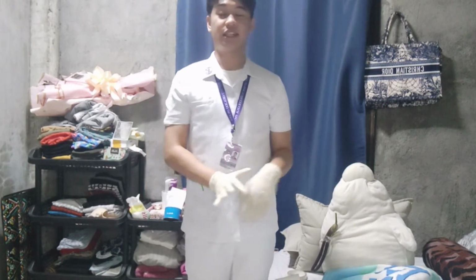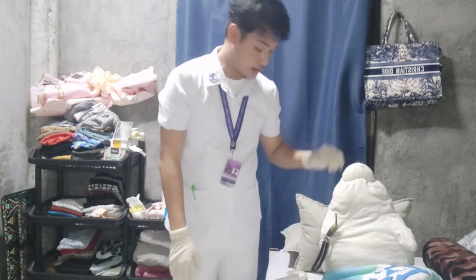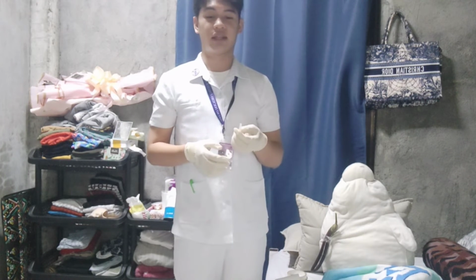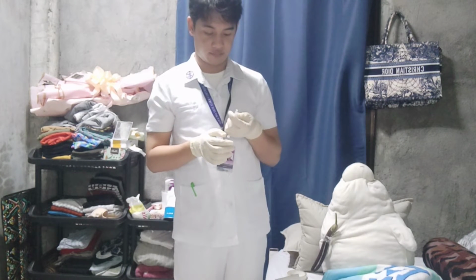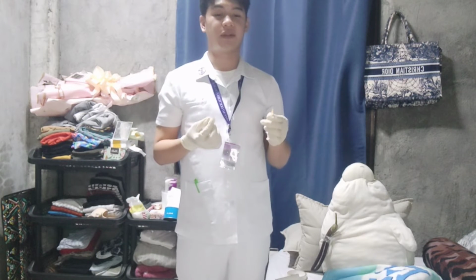So we need to prepare the syringe for injection. We need to remove the needle cover and discard it without contaminating the needle. Pulling it straight up helps to prevent needle prick and aids in not contaminating the needle.